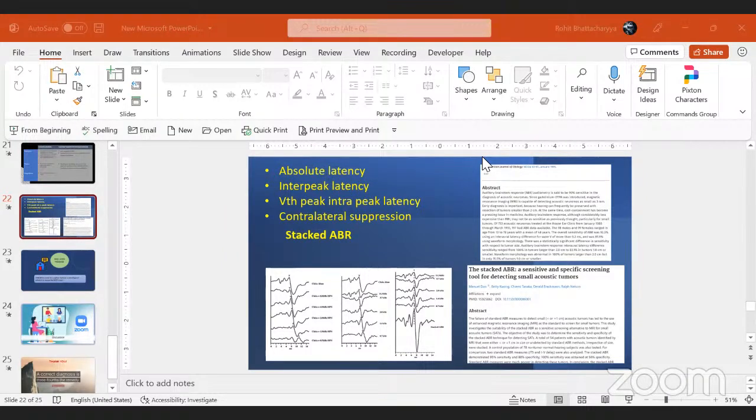So not just based on the pattern of audiogram, but based on everything. We can also take the help of VEMPs in such cases, if we have doubt regarding Meniere's disease, because that also helps in accurate diagnosis. Of course we can get an indication from the pattern of audiogram, but we also have to look at the entire test battery before we say that it is a particular case of retrocochlear pathology, cochlear pathology, or conductive hearing loss.